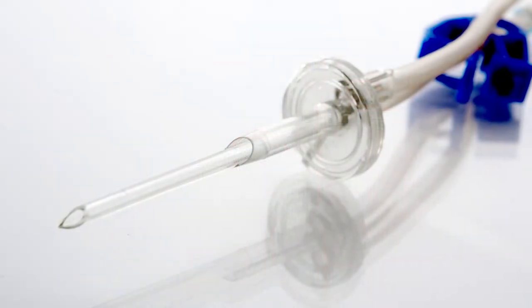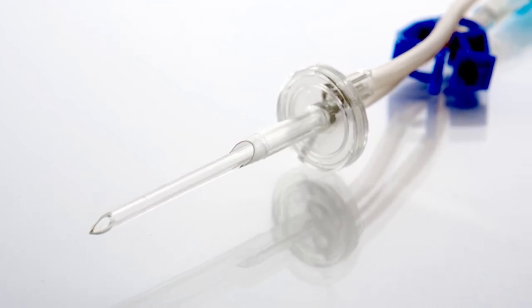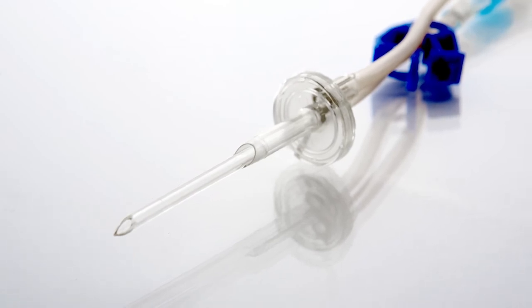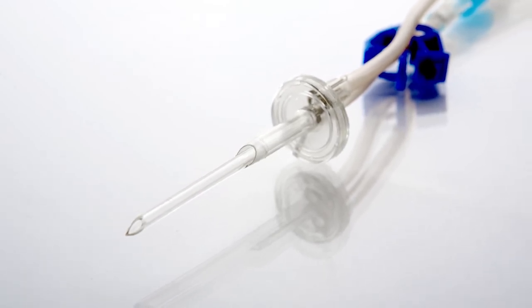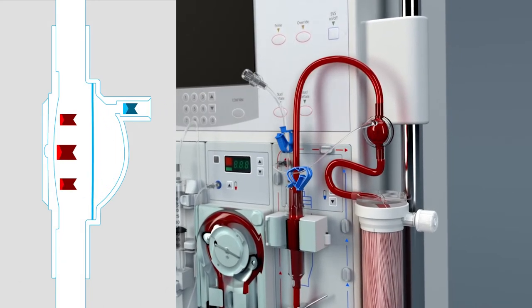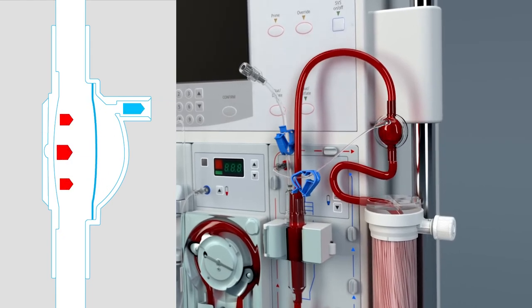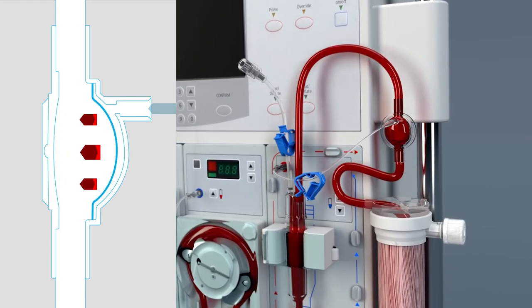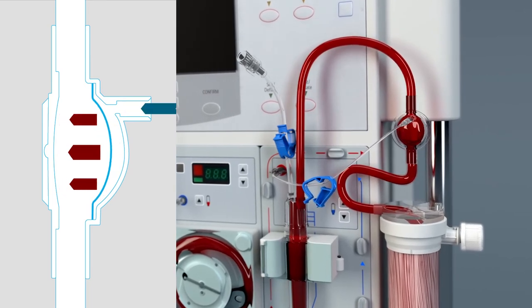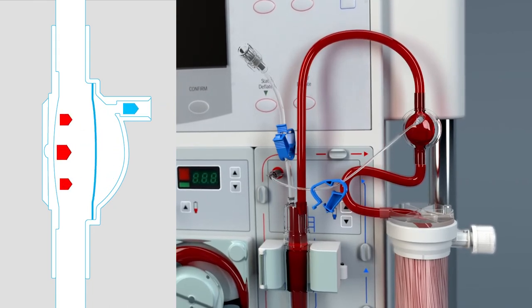The dual lumen spike featured at the end of the blood tubing set also reduces the amount of saline used during each procedure, eliminating the need for waste buckets during priming and the potential areas of contamination. The arterial and venous pressure pods create a barrier between the patient's blood and the dialysis machine, eliminating the need for transducer protectors. The use of conventional transducer protectors presents a risk of transducer wetting or strikethrough, which poses a risk of cross-contamination.